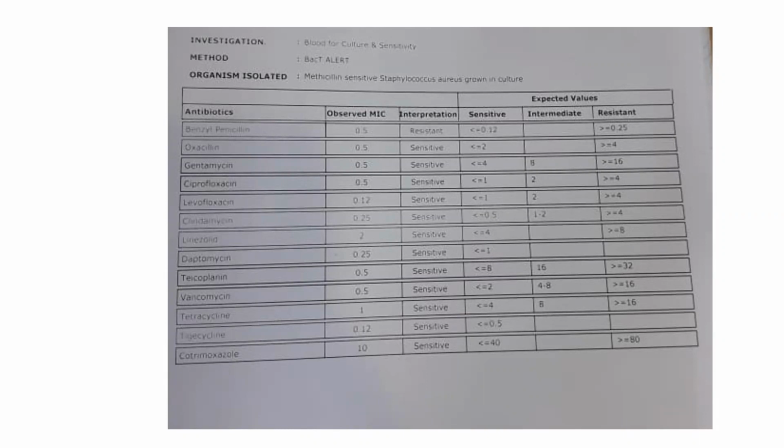Okay, sir. So another question. This is the last question for this report. When you say disk diffusion, we understand how it works. There is a growth. You put an antibiotic onto it, and with that antibiotic, it inhibits growth. You see an area of inhibition, and that way you know whether this bacteria is sensitive or resistant. Same thing is with your E-strip. It makes sense. This is intuitive to us.